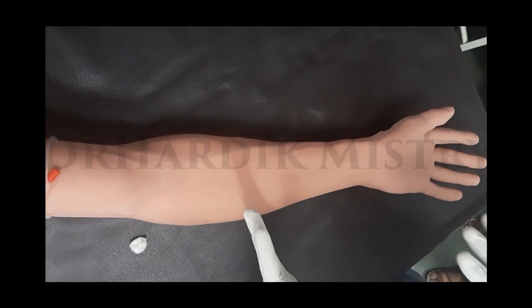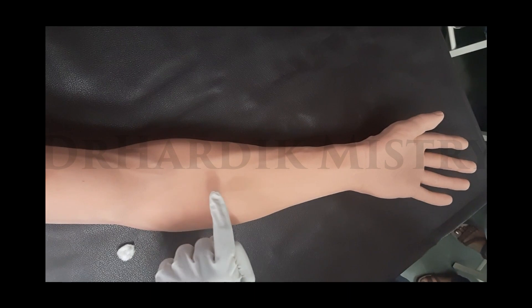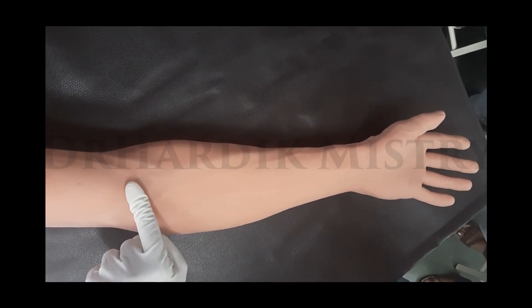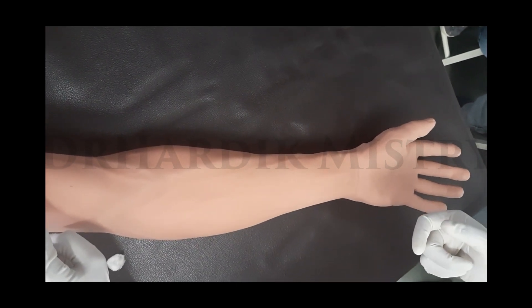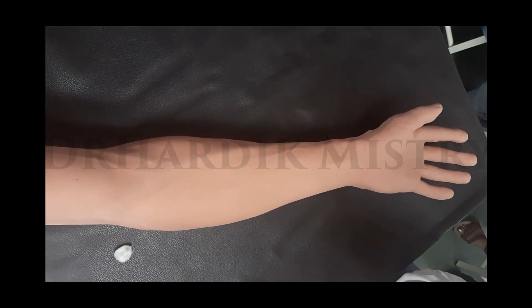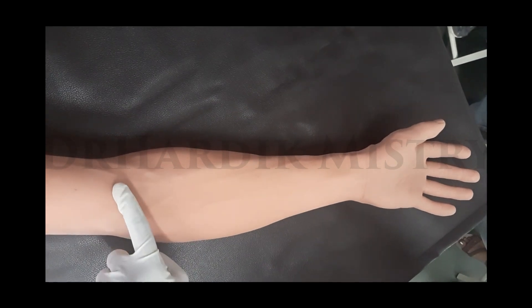This vein becomes more bluish and discolored, as well as more prominent. It will be easy to identify, so we have to apply the tourniquet before the collection of the venous blood samples. Before we begin our collection, with the help of our fingers we have to palpate the prominent veins.